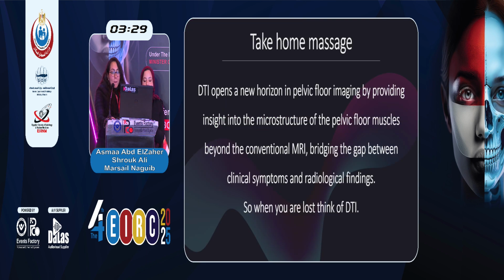So, our take-home message today: DTI opens a new horizon in pelvic floor imaging by providing a deeper insight into the microstructure of the pelvic floor muscles beyond the routine conventional MRI, bridging the gap between clinical symptoms and radiological findings. So, when you are lost in this era, think of DTI.